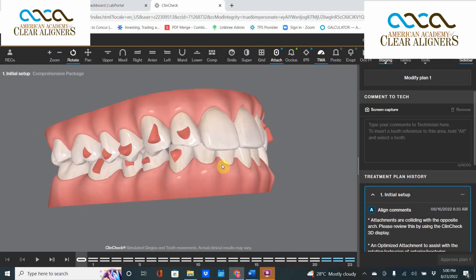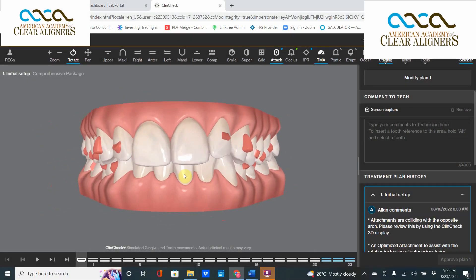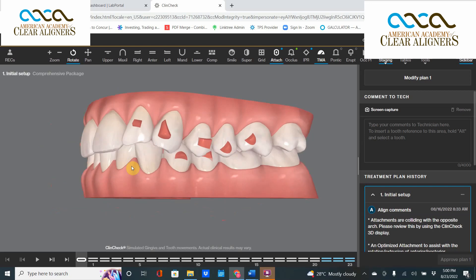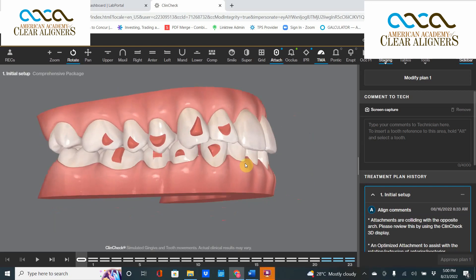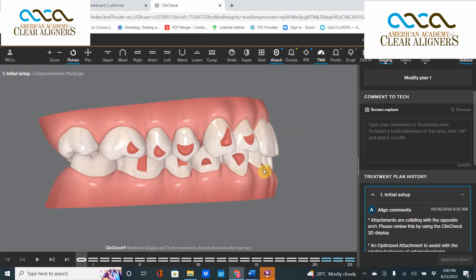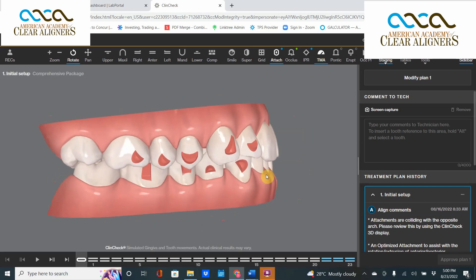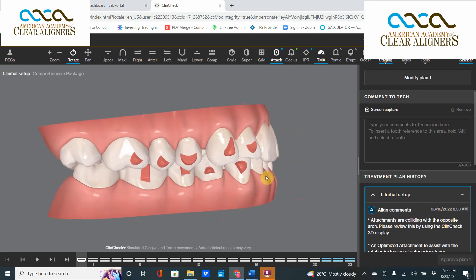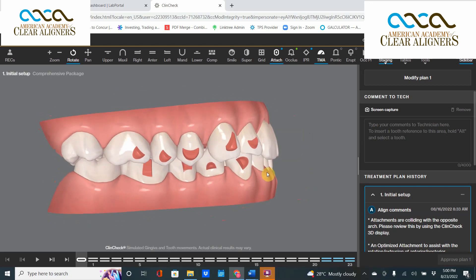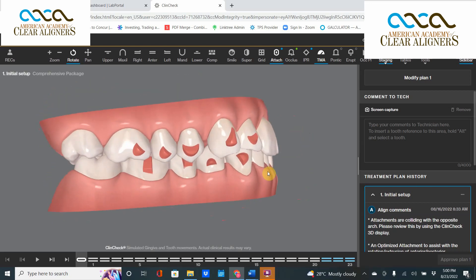Good morning and welcome to another edition of ClinCheck Theater Thursday. I'm your host Dr. David Gallin. Today we're taking a look at a very important glitch that happens within Invisalign. If you're using Treat software, the Go software, anything that requires a technician, the technician will fix it before you even see it. But if you're using Galer Engine, there's no technician, so it's up to you to see it.